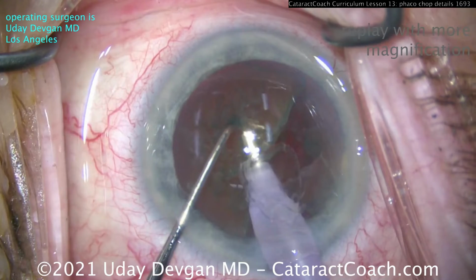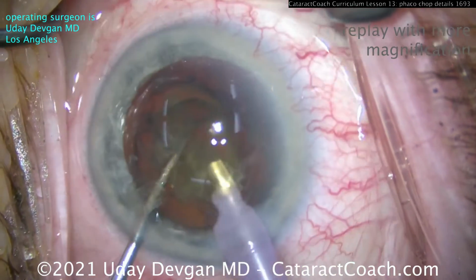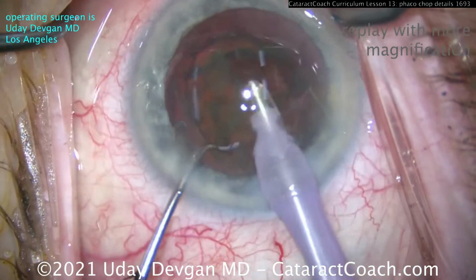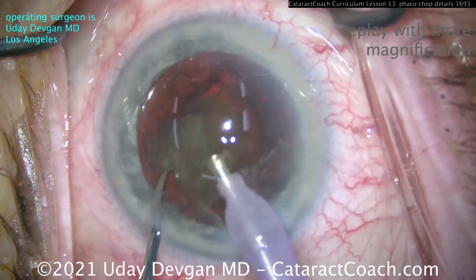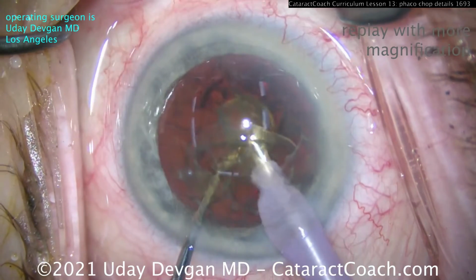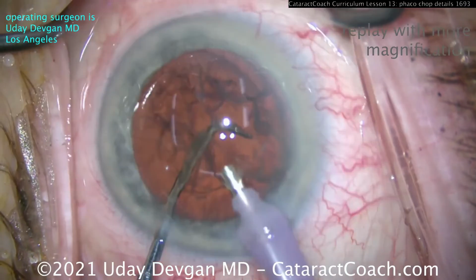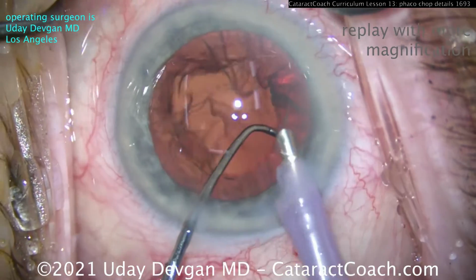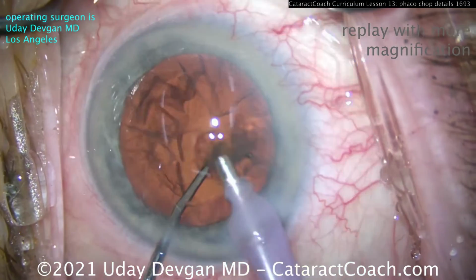Now the last half, I'll show you a traditional horizontal chop, which is chopper going around the lens equator. And then now you can break off a quarter, and then the last quarter is in the capsular bag. And then notice how we keep the eye in primary the whole time. And then the chopper is being used now to push that last piece in front of the phaco probe, so pushing it. And now the back end, the smooth side, the curved side of the chopper is going to be facing the posterior capsule. Just in case there's some surge that we weren't planning, we don't want that posterior capsule to come in contact with the phaco probe. And then that looks great, taking out a little bit of an epinuclear shell there, and there's the last little piece. So very nice technique.